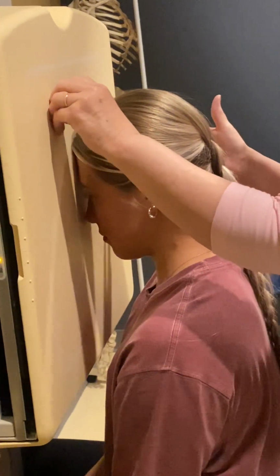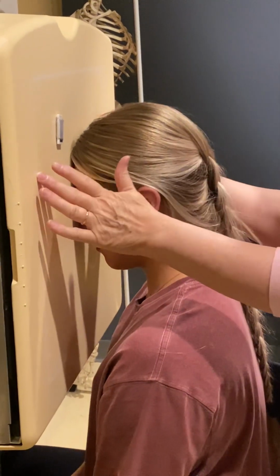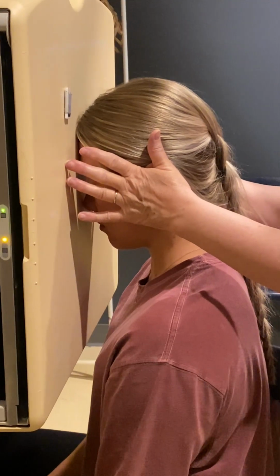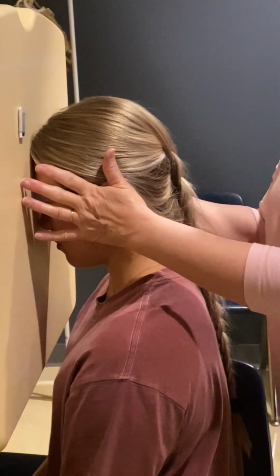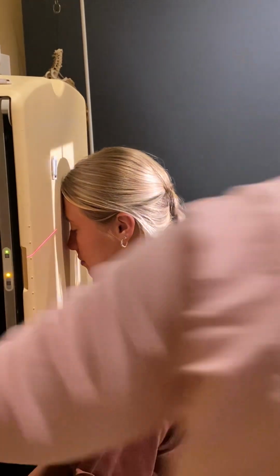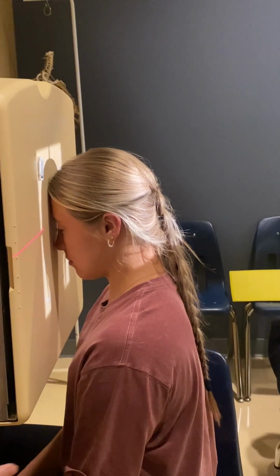Now here's another thing. When you're looking for rotation, you have to put your fingertips on here. Come in against your patient. And you have to feel for rotation and take it off if you feel it. All right, and then we'll check everything. Okay, that is our PA Axial Caldwell. So we're done with that, and you can relax from there.